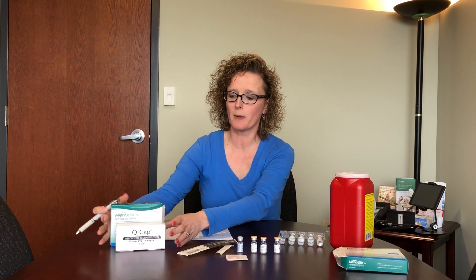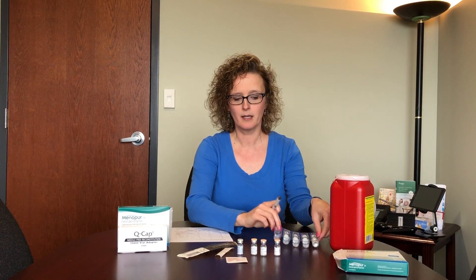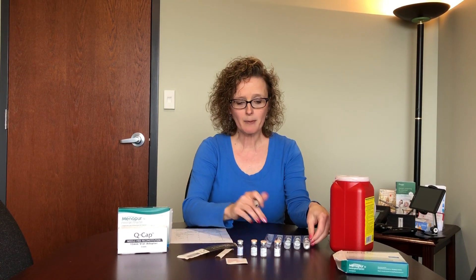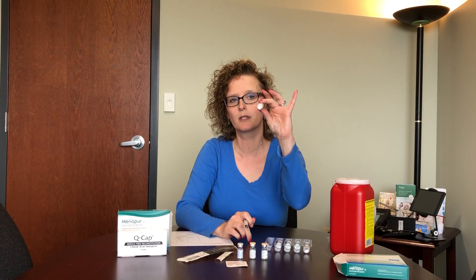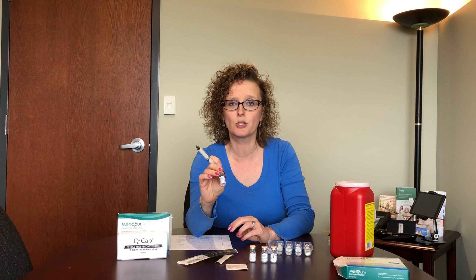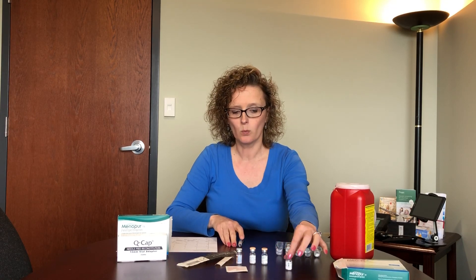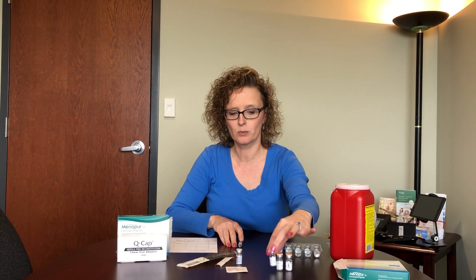Menopur is going to come in a large box with two boxes inside of it. Inside the bigger box, labeled Menopur, is your medication. It's packed with five vials of Menopur in powder form, and it also comes with five vials of saline to mix the medication with.